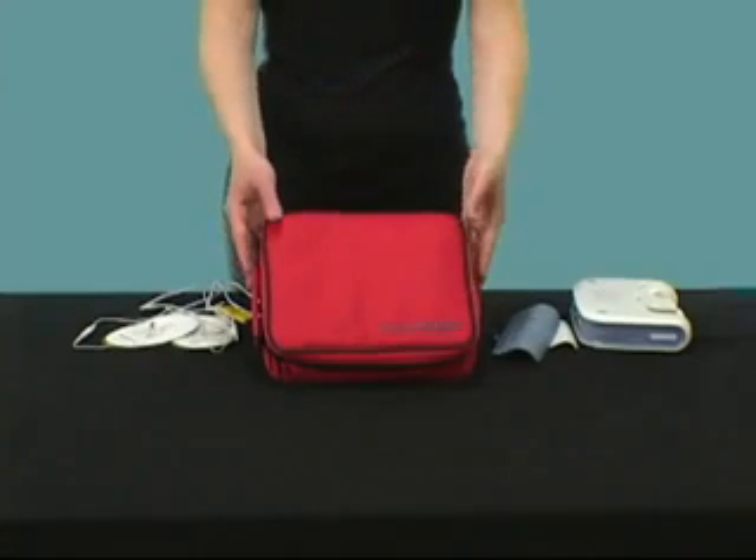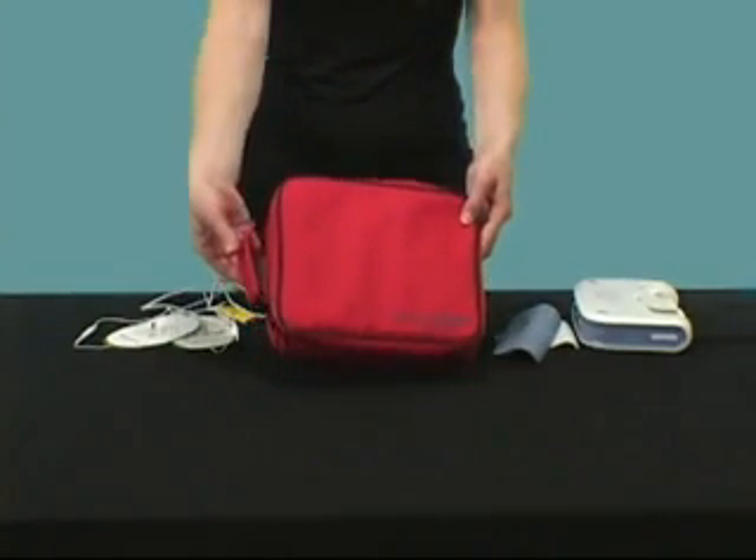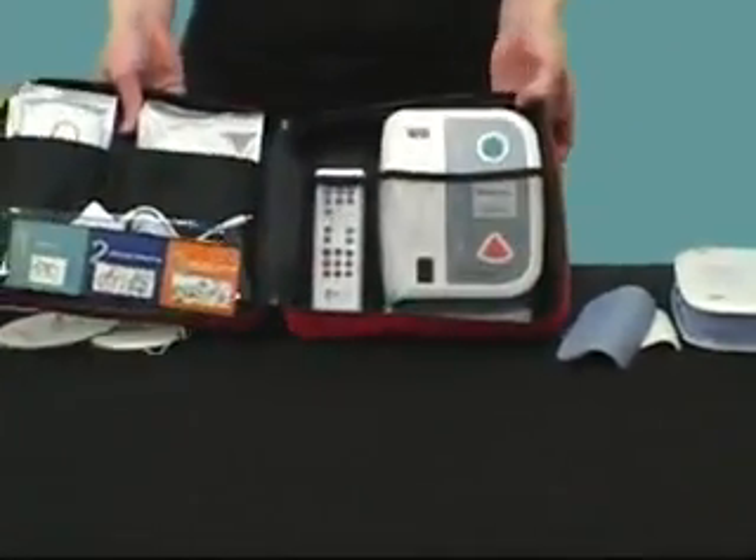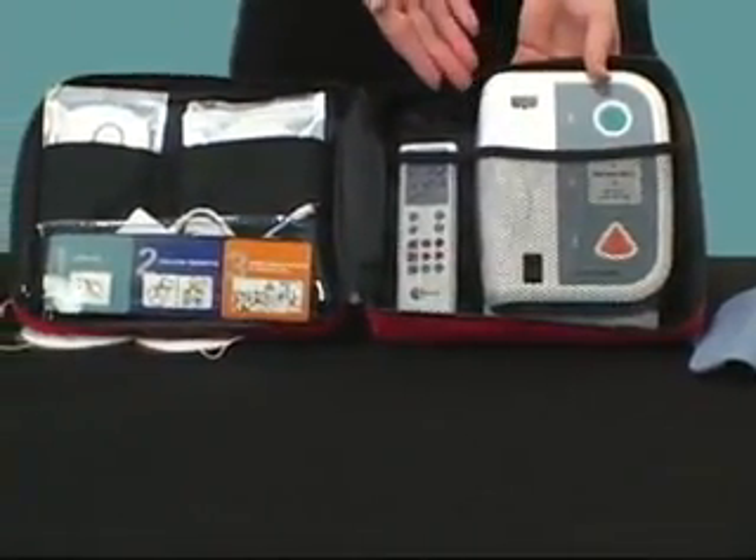The PractiTrainer is a great and affordable tool for AED training. The PractiTrainer comes in a zippered carry case with a handle. Inside the case is the PractiTrainer and all the accessories you need to operate it.